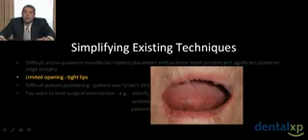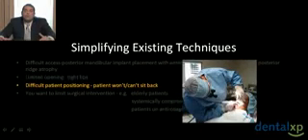So we all have those patients who have those difficult scenarios. They may have limited opening, right? Limited opening can be challenging for employing some of the tools that we use. But again, limited opening, even with conventional tools, can be somewhat difficult for us to access and see what we need to see. And computer guidance allows us in those scenarios to have a little more, and I hate to use the word blind procedure because nothing should be done blindly, but we can do it a little bit more blindly using computer guidance.